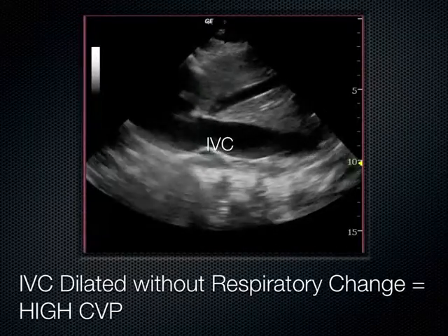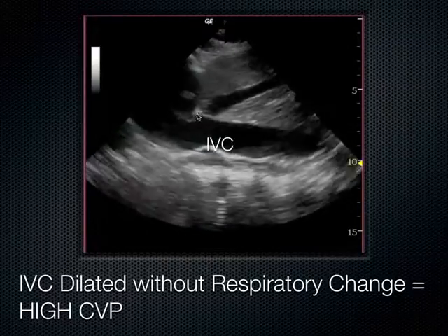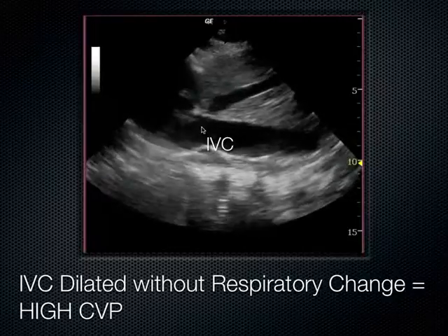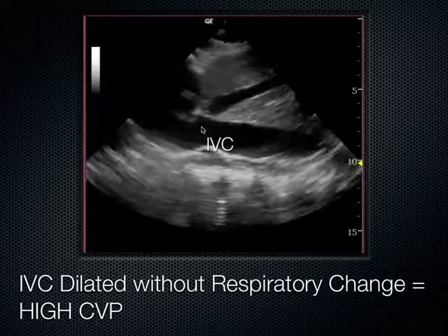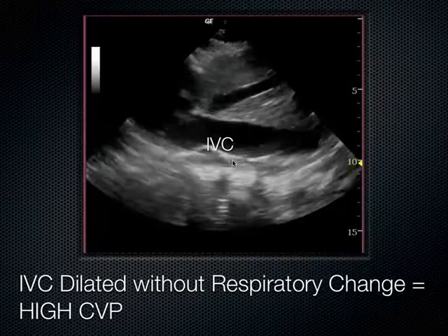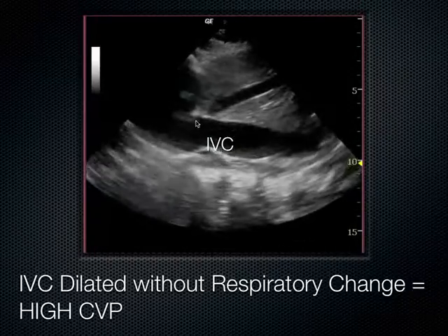Again, here's one that's plethoric, it's very large, doesn't change with respiration. In this case, though, I want to point out the hepatic vein. Hepatic vein drains into IVC. The location in which to really focus on the IVC's diameter change is about 2 centimeters distally to where the hepatic vein drains in.